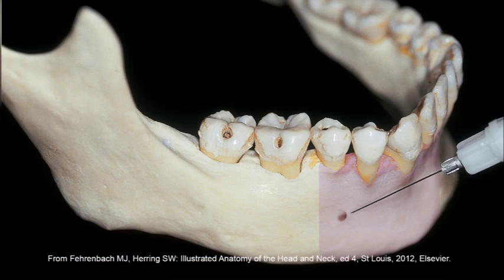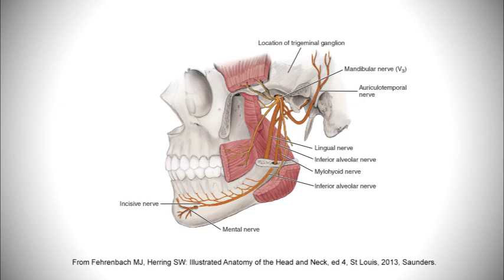The mental block is used to anesthetize the gingival tissue of the mandibular anterior teeth and premolars on one side. The incisive block anesthetizes the pulp and periodontium of the mandibular teeth anterior to the mental foramen, usually the mandibular premolars and anterior teeth, as well as the facial gingival tissue. Both injection techniques are nearly identical, with one exception.